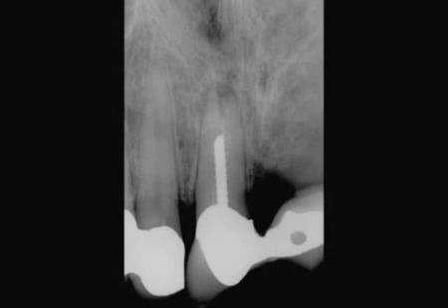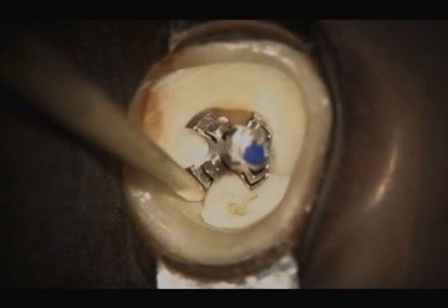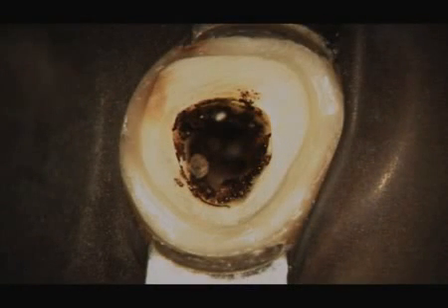This case will help us review our Type 2 transportation technique. In this pre-op film of a maxillary right central incisor bridge abutment, note a post, and an empty system that exhibits reversed apical architecture. We use ultrasonics to remove the post, and a subsequent photograph confirms the disassembly. Note the breakdown products. The canal is reshaped, cleaned, and high magnification reveals the foramen.